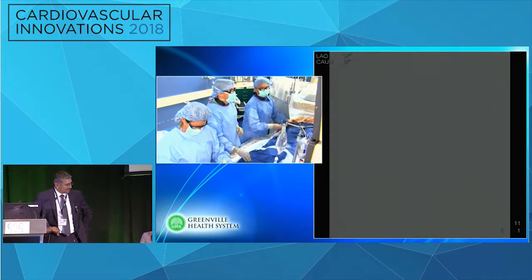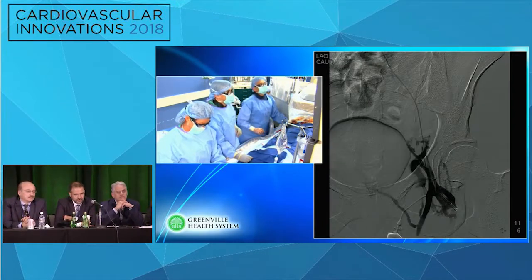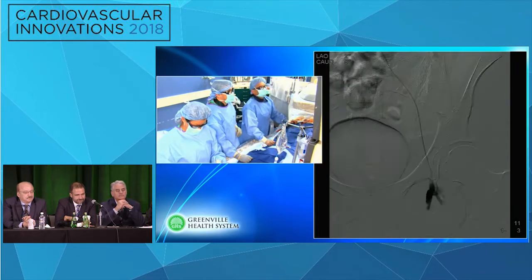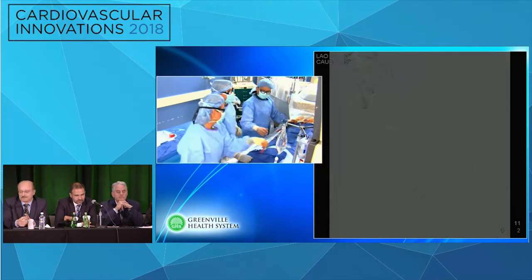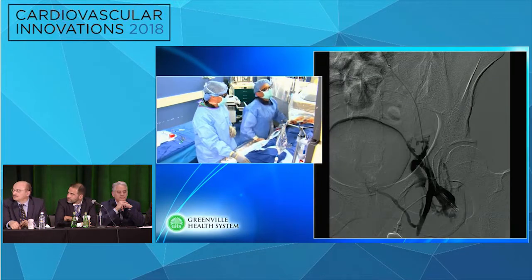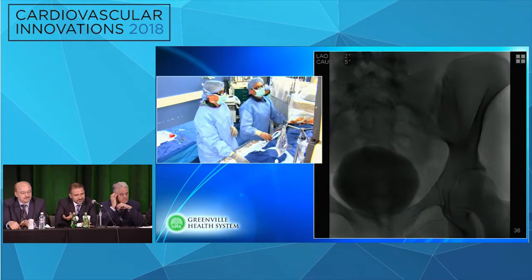Obviously, the one that a lot of us use is to have a support catheter come over the wire and then take a picture to make sure that you're in the right place. That's another one. I think those are the two. I don't know if I'm missing anything else. Or maybe advance the wire from the other side and see if it comes close, to get some guidance, or you don't think that's useful? I mean, that one you have to be careful, because they're going to have to dilate it multiple times all from this side.